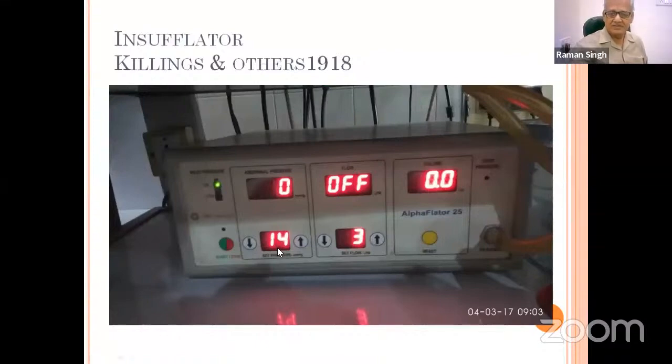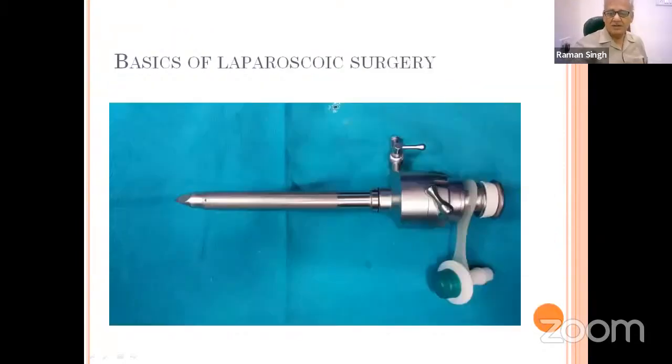So after creating pneumoperitoneum, the other instrument, this is your insufflator. Here the pressure is fixed up to 14, and this is the flow rate, and this is the present pressure in the abdominal cavity. And here it will indicate how much carbon dioxide has gone into the abdominal cavity. The next important instrument, which we insert blindly after creating pneumoperitoneum, is the port.